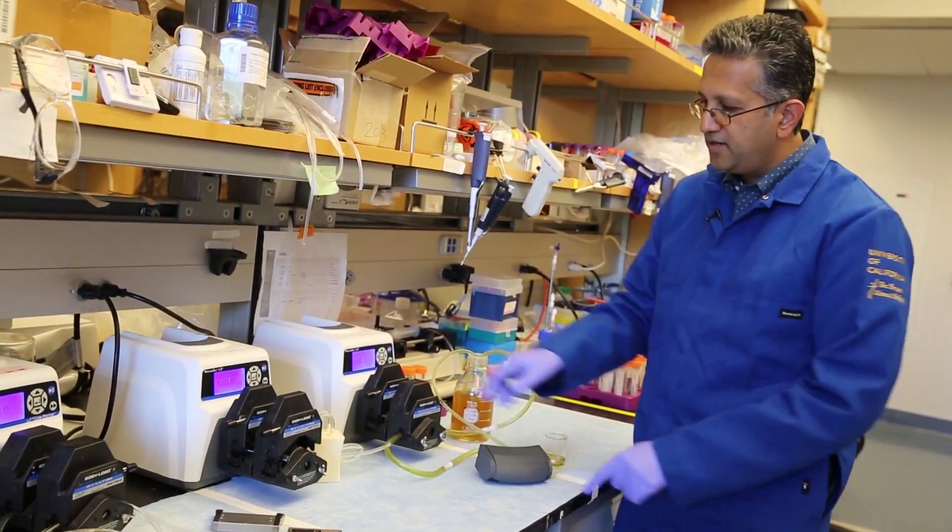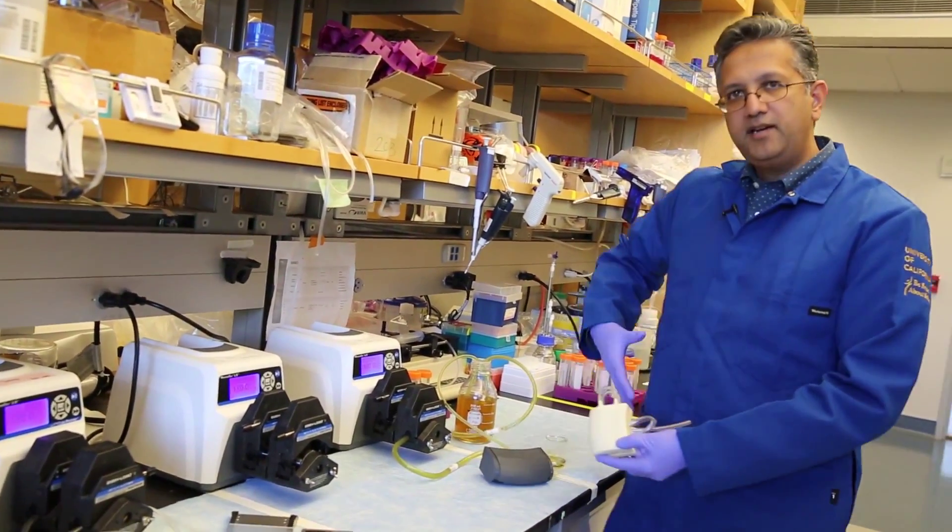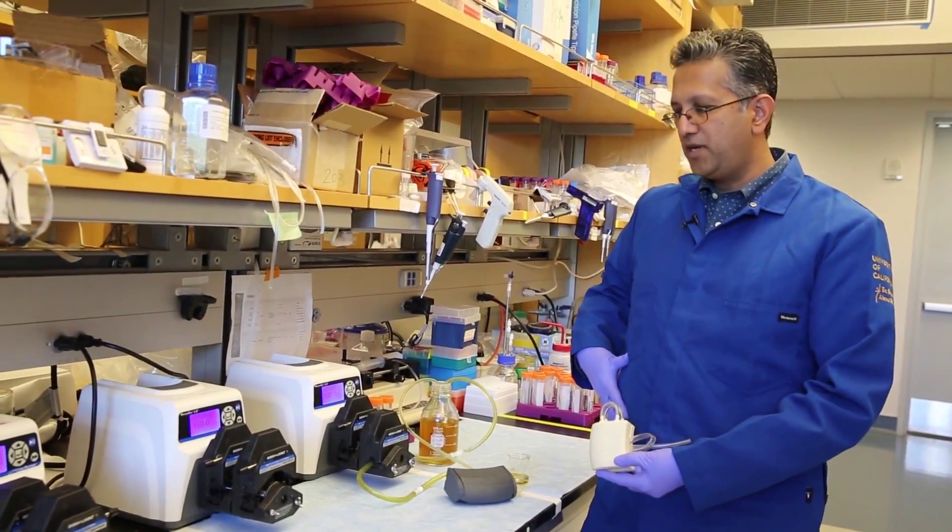While this is the current size, our final device will be more about this size, and it will be surgically implanted into the abdomen very much like a kidney transplant today.